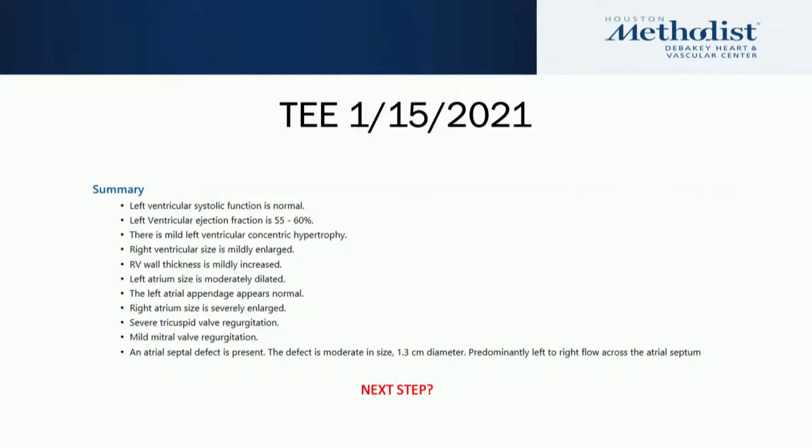So what is the next step at this point, now that we have the data? So we have the answers, but what are the questions that we need to ask, and what's the next step that we need to take?